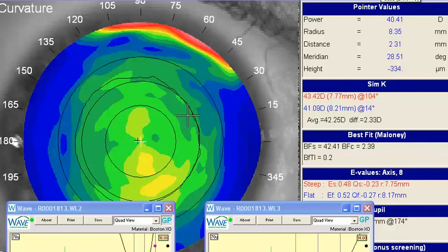Wave support. I see from your case that you're struggling both with the fit on this patient due to scleral compression from the lenses, as well as weird overrefractions. At first glance, this looks like a relatively straight case from a power standpoint, where the corneal cylinder roughly matches the refractive cylinder, and therefore you anticipate a pretty straightforward result.